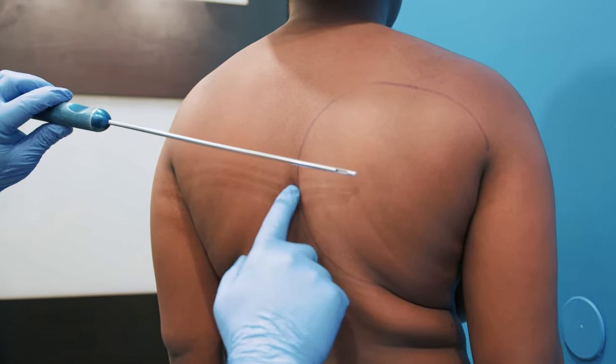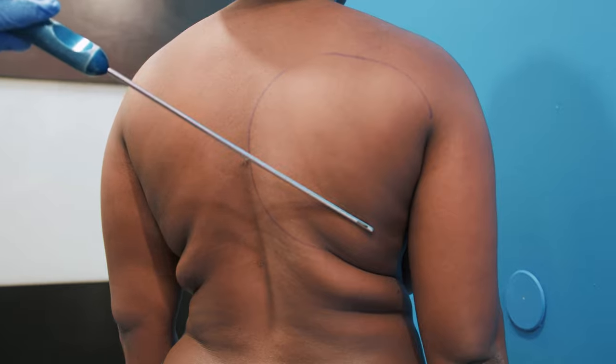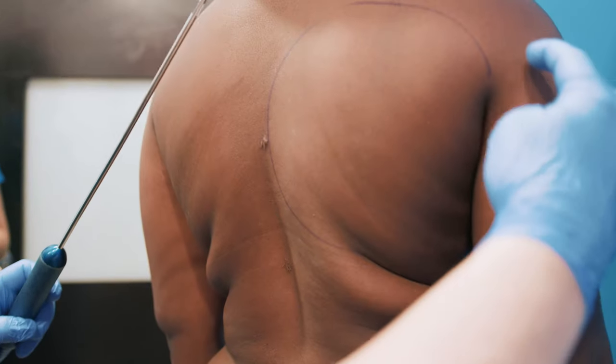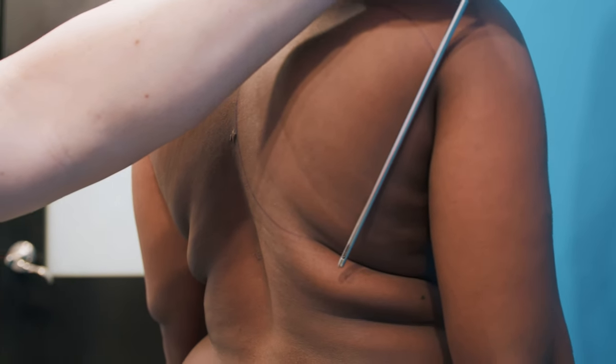If I just make an incision here, this is really where I can lipo to. But these straight cannulas can't get around corners. So I always make an incision up here in order to be able to get the cannula into this area.